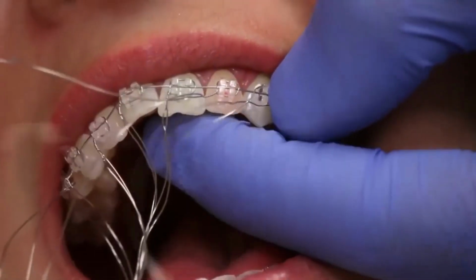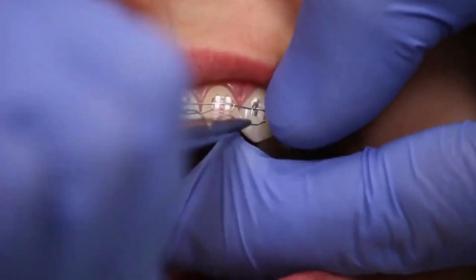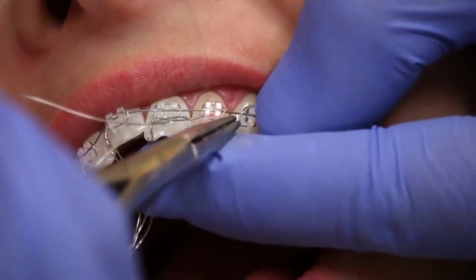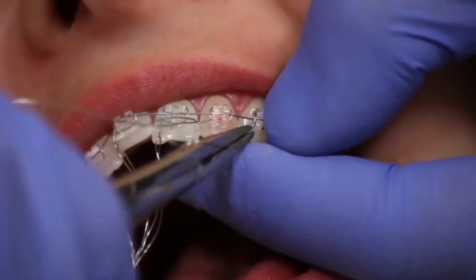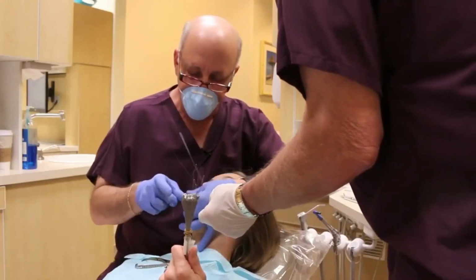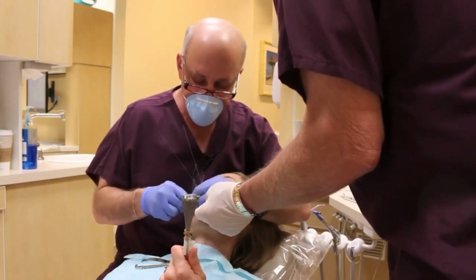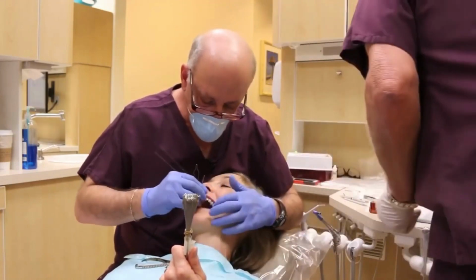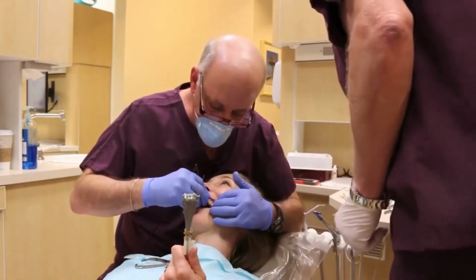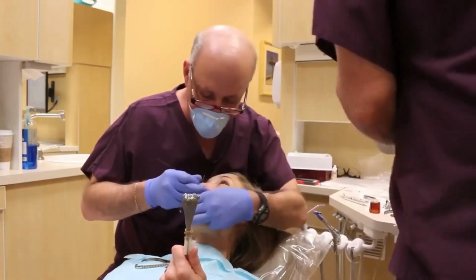So the tying process is not a complicated one. Just make sure that you keep your pliers not too far away from the tooth. I always keep twisting the excess wires so they are not in my way, and by putting them all together, I don't have to worry about picking one wire at a time when we're cleaning up and cutting the excess ligature ties.